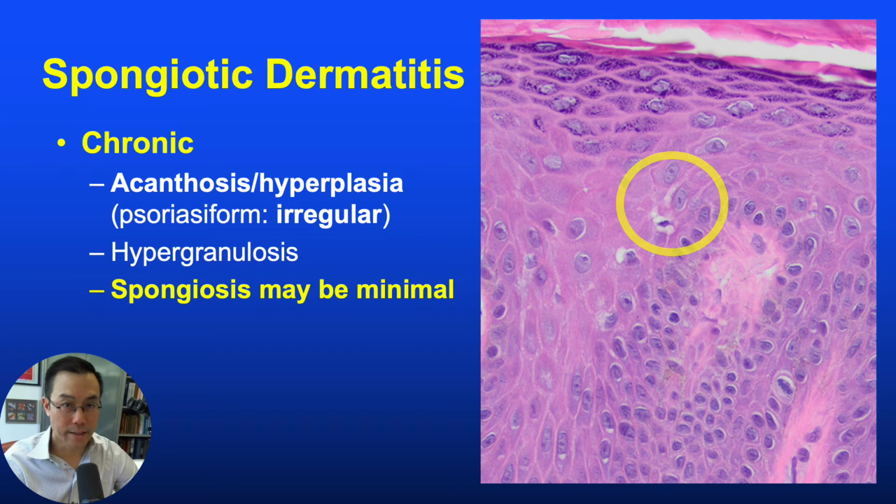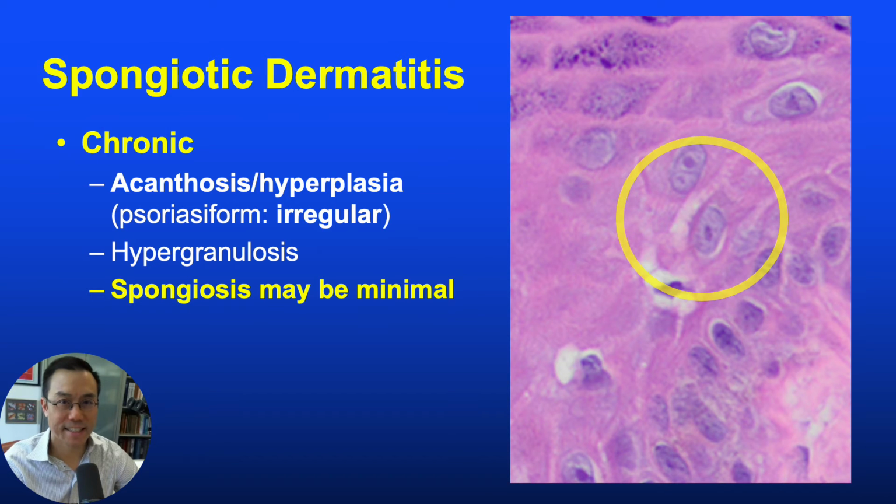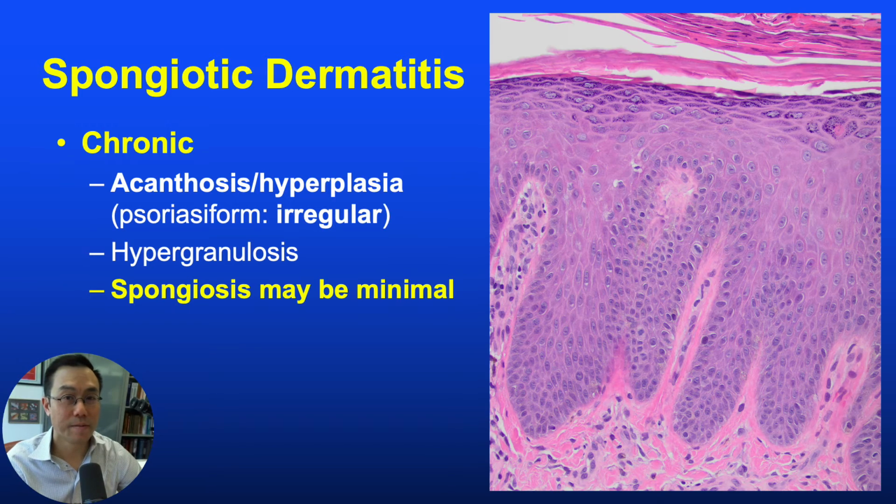There's just a little bit here. Now, can you see it? And now, still?